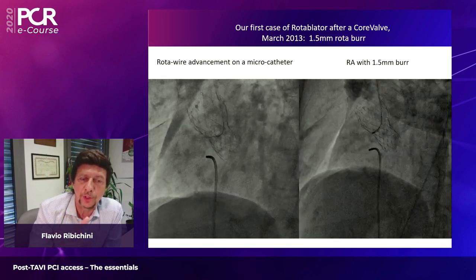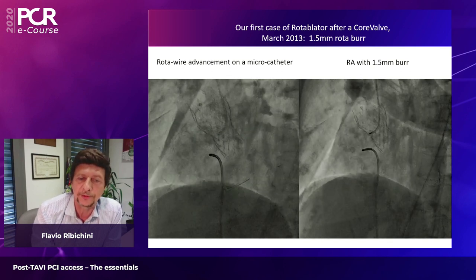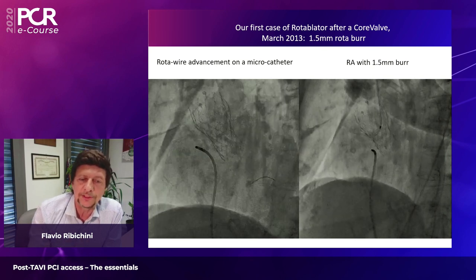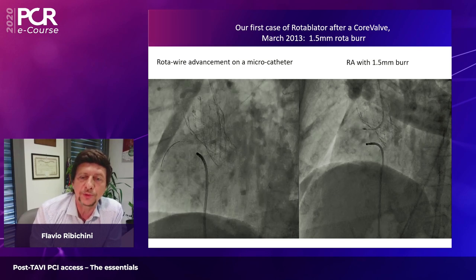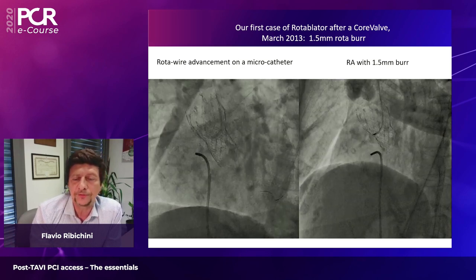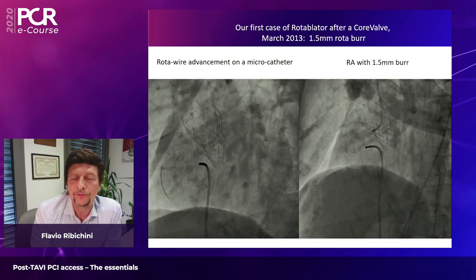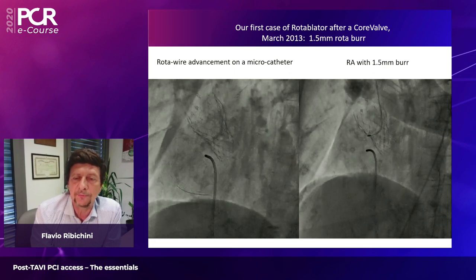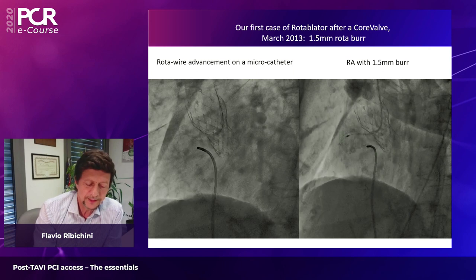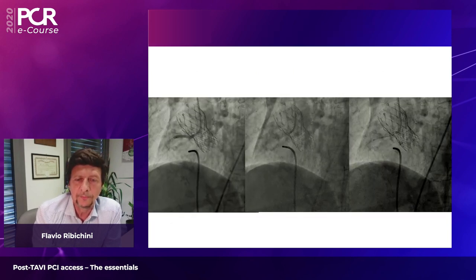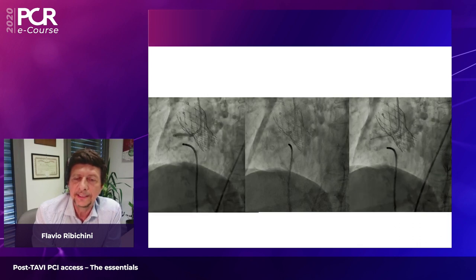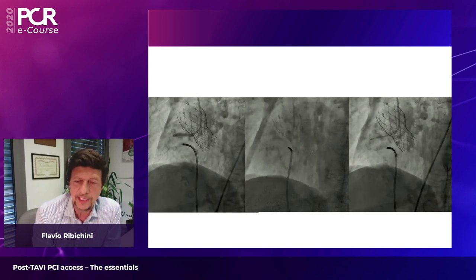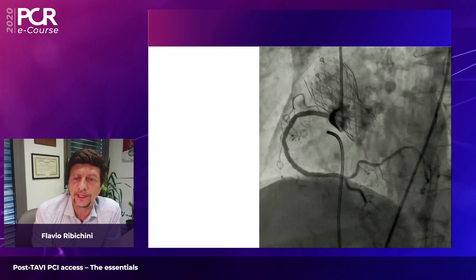The first thing was to cross with a pilot 50 wire, then put a micro catheter, retrieve the pilot and use the micro catheter as a rail to advance the rota wire. Then a regular rotational atherectomy was performed with a 1.5 burr on this bulky calcification of the right coronary artery. The rest was a regular procedure: balloon dilatation and drug-eluting stent navigation through the struts of the valve, with stent positioning yielding a good final result.